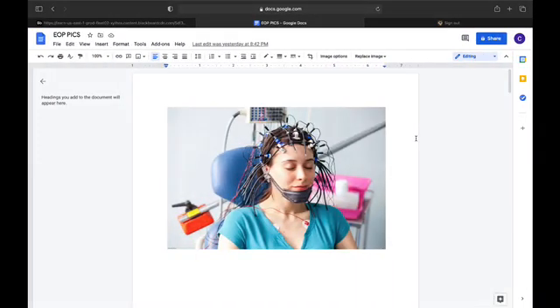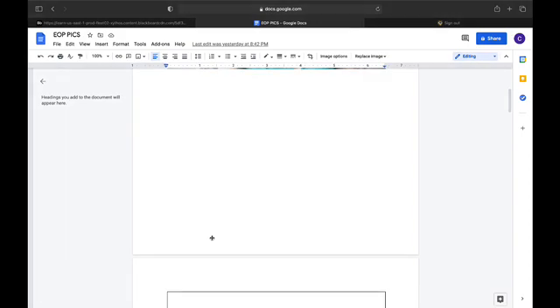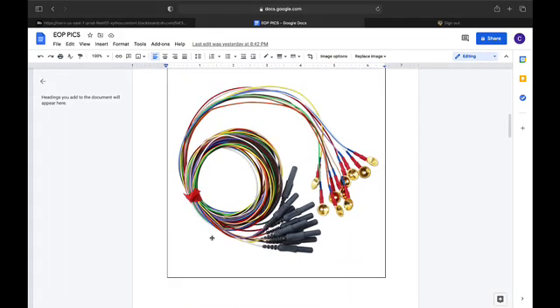This is what a person looks like while taking an EEG scan. The things attached to her scalp are metal discs that are called electrodes, and this is where the ends hook up to the machine. This is a closer example of what the electrodes look like when not on the scalp. These are the metal pieces and the plastic ends that hook up to the machine.